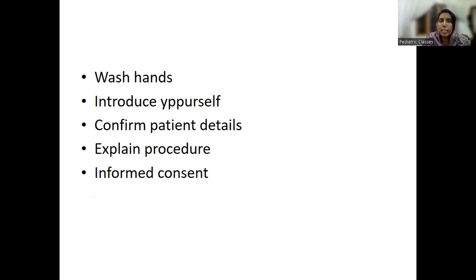As in any other procedure, we have to wash our hands. Suppose you're doing it on a patient, you have to introduce yourself. I put this in because postgraduates may have these OSCE stations. So first wash hands, introduce yourself, confirm the patient details. Then explain the procedure to the patient and get informed consent. What exactly the procedure is, you will learn now. And then only you will start the procedure on the patient.